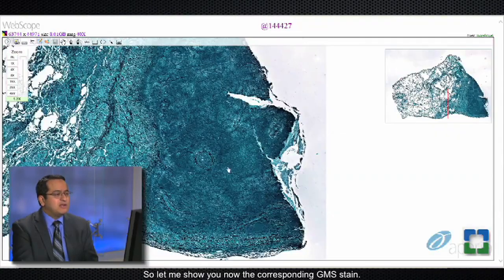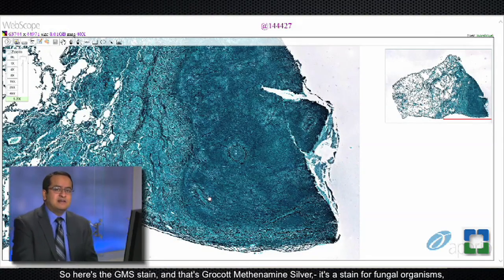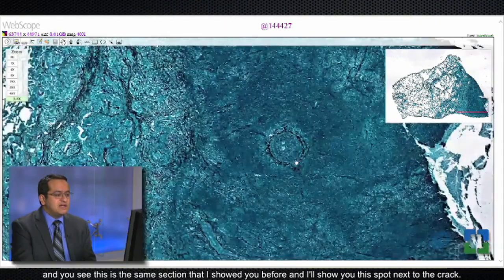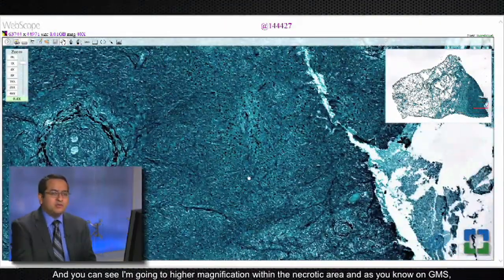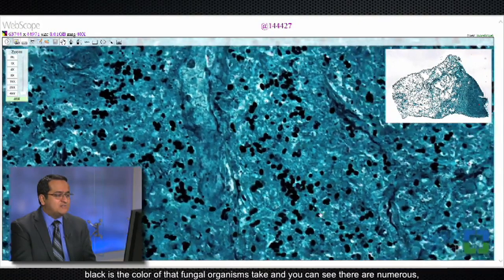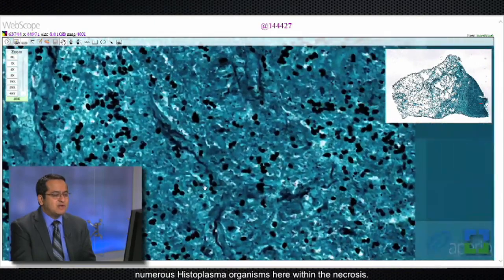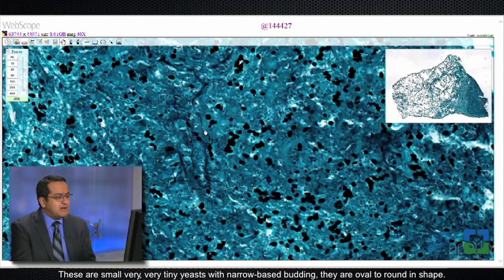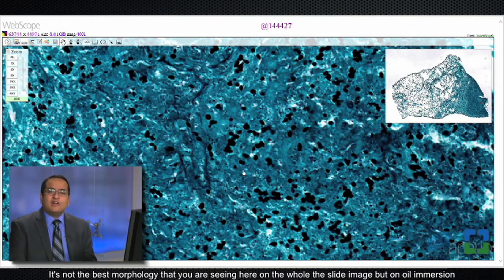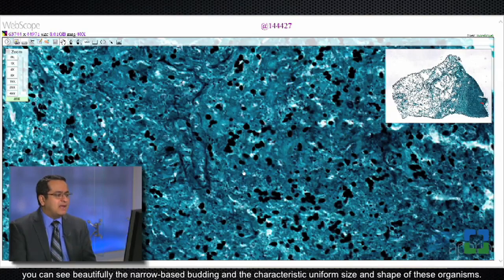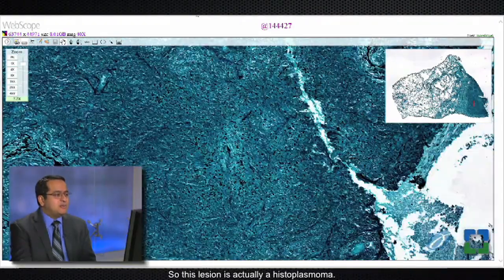Now let me show you the corresponding GMS stain — that's Grocott methenamine silver, a stain for fungal organisms. This is the same section I showed you before. Going to higher magnification within the necrotic area: as you know, on GMS black is the color that fungal organisms take, and you can see there are numerous histoplasma organisms here within the necrosis. These are small, very tiny yeasts with narrow-base budding, oval to round in shape. On oil immersion you can see beautifully the narrow-base budding and the characteristic uniform size and shape.